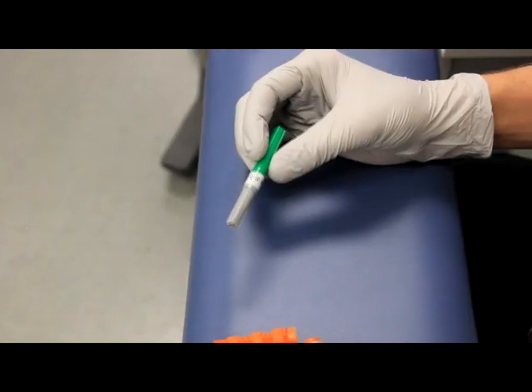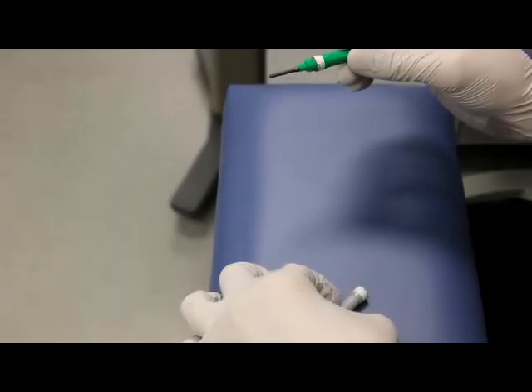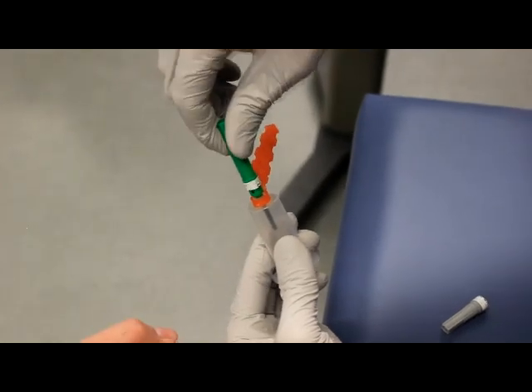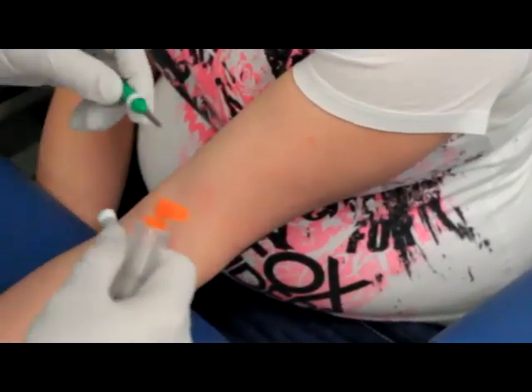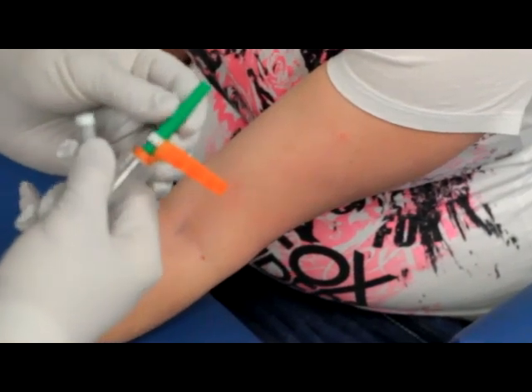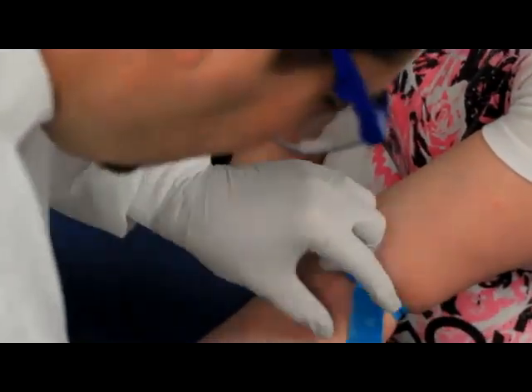The preferred method for blood collection utilizes an evacuated tube system, or ETS. Begin by assembling your equipment. The needle is capped on both ends; by holding both ends and twisting, the cap will expose the rubberized sleeve for insertion into the ETS holder. Insert the needle through the opening in the holder and screw the threading on firmly. Do not remove the cap until ready for use.